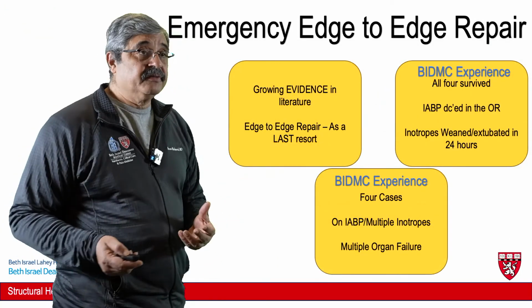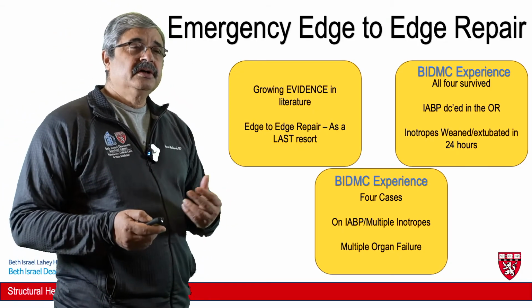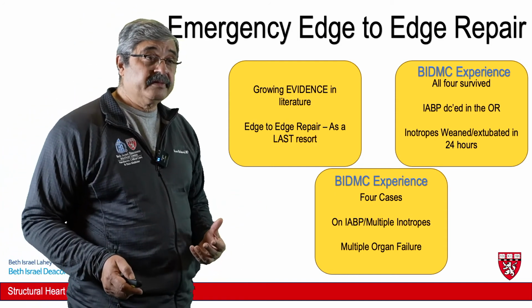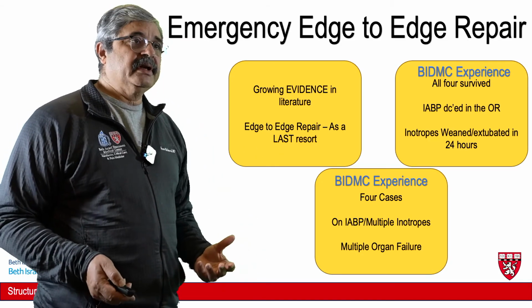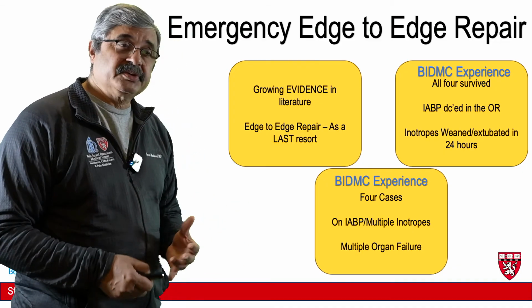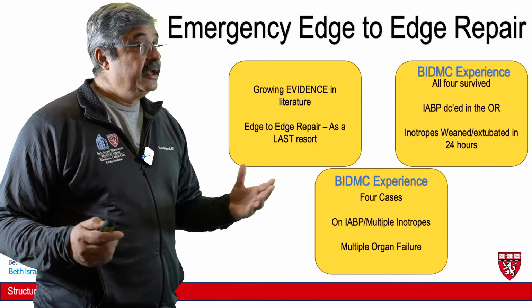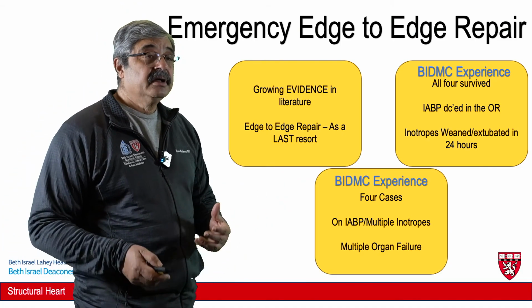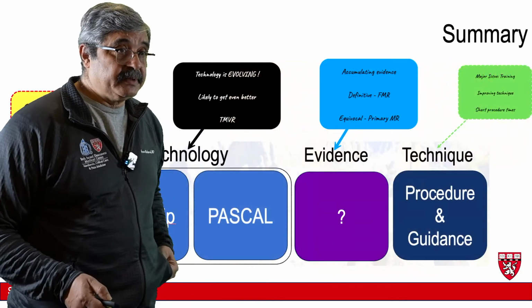Now there's evidence of these clips being done in emergency. There's growing evidence in the literature in patients who are terminally ill with ruptured papillary muscles, other such problems, organ failures, who are at prohibitive risk for surgery. You can have a Hail Mary and do a mitral clip in these situations, and some of them do very well. As a matter of fact, in our own medical center, we've had 4 cases on intra-aortic balloon pumps, multiple inotropes, multiple organ failures, in whom we did mitral clips or edge-to-edge repairs in an emergency, and fortunately all 4 survived. The intra-aortic balloon pumps were discontinued in the operating room, the inotropes were weaned, they were extubated within 24 hours, and all of them were discharged from the hospital.